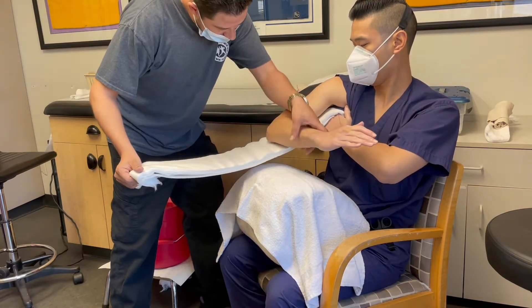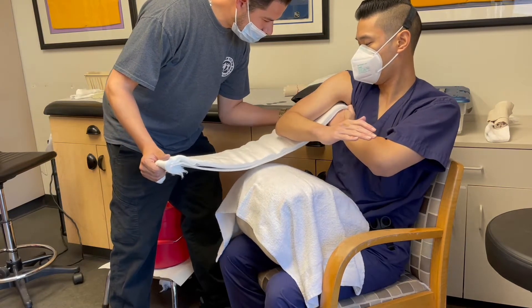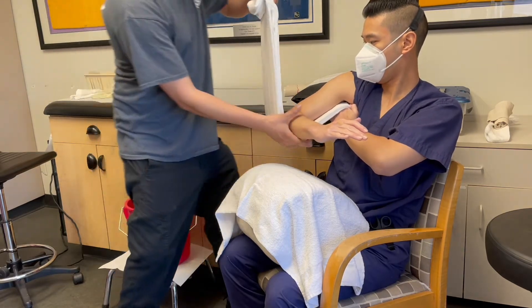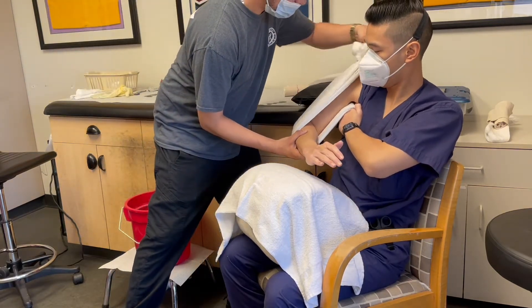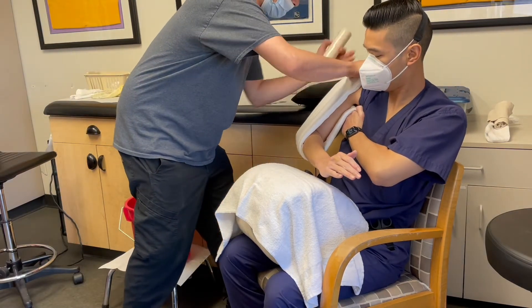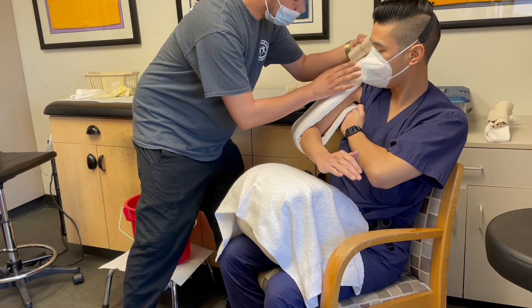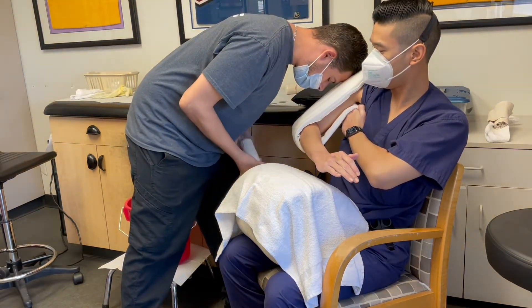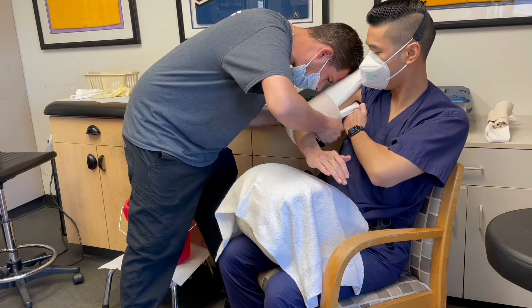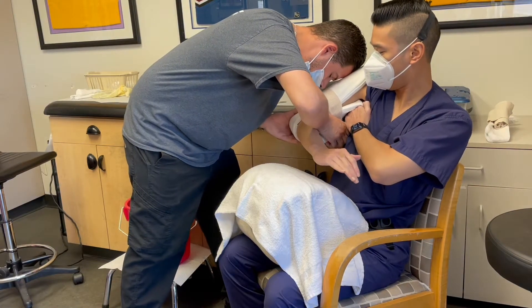We'll have the patient hold the splint underneath their axilla. Position the patient with the elbow flexed 90 degrees. Wrap the splint around the elbow if you're having to drop the arm. You can have someone else help hold the splint at the top. Keep the elbow flexed at 90 degrees and go ahead and start wrapping the splint.